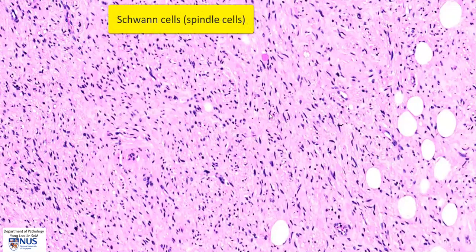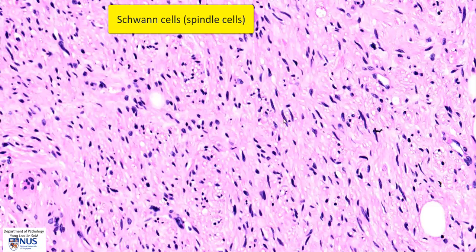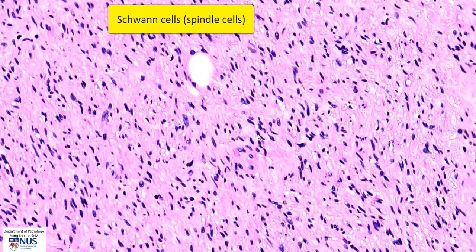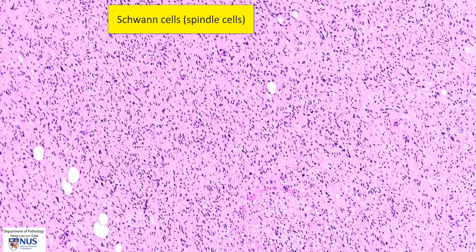The tumor is composed of spindle cells with very slender, elongated nuclei. Some of these nuclei are a little bit wavy as well. These are Schwann cells, and they are arranged in parallel bundles or fascicles. This is one of the components of ganglioneuroma — the neuroma component.